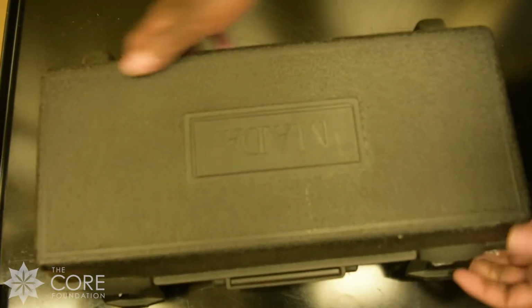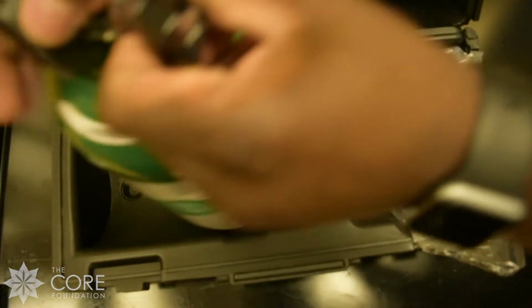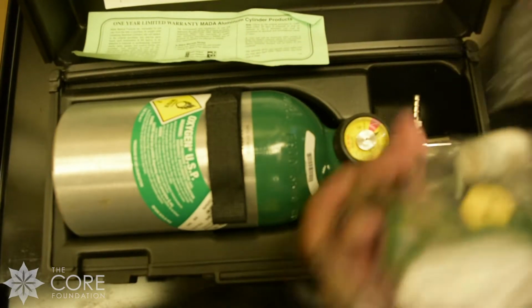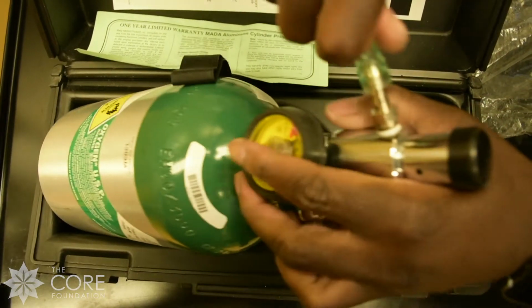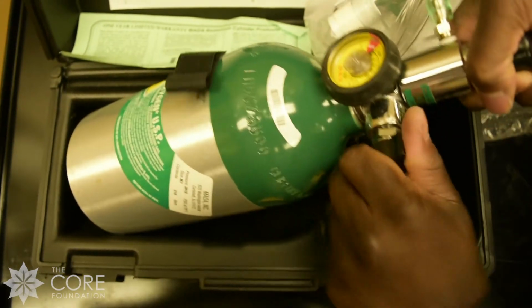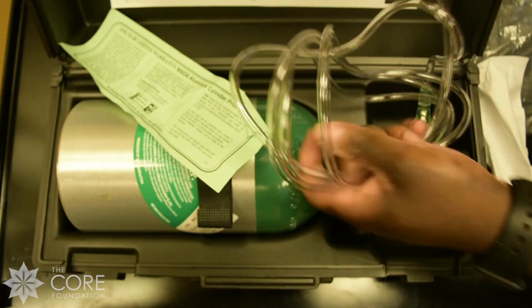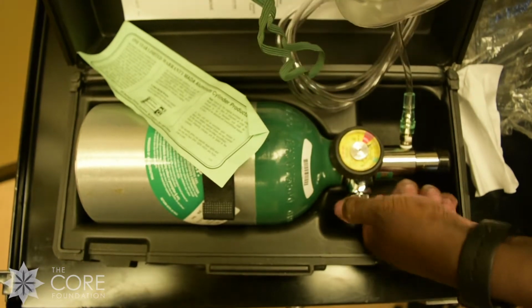The other material that we have is a portable oxygen tank. Now, in case of an emergency, you just grab the oxygen tank. It usually comes with a couple of hoses. I'm going to open this one. Attach the hose right here. Make sure it's fully fastened. And then you want to open up the oxygen. As you can see right now, it's going in. So you would take this, cover it over the patient's face, and then have the patient breathe through here. Good.